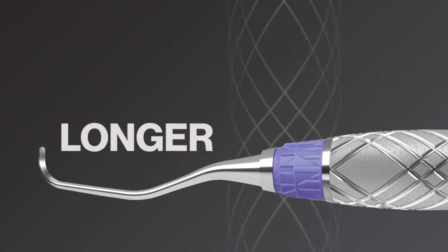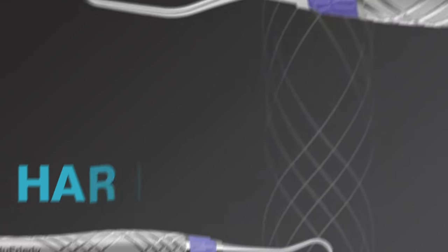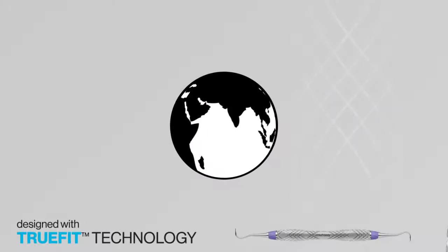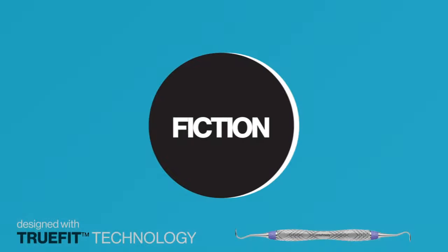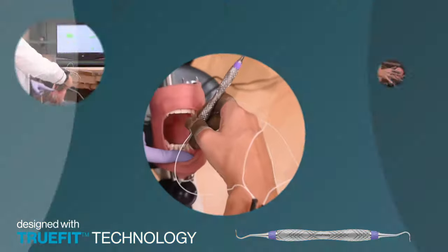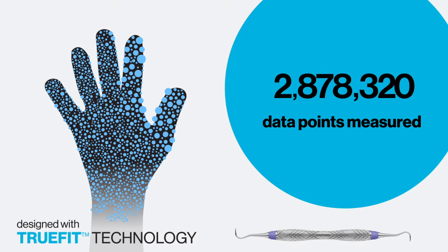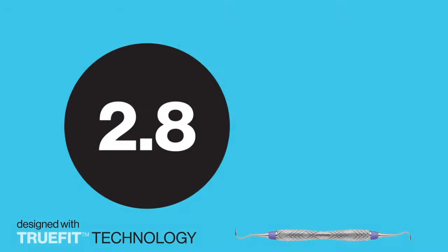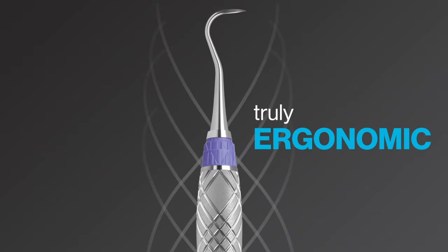All of these features work together in perfect Harmony to be truly ergonomically fit just for you. Harmony Ergonomic Scalers and Curettes are designed with TrueFit technology. Hu-Friedy Group scoured the globe testing different designs and gathering input with one goal in mind: to distinguish factual parameters that could be used to develop a truly ergonomic instrument handle. TrueFit technology is an advanced sensor-based technology system that measured over 2.8 million data points, creating a massive database to improve dental ergonomics. That is 2.8 million reasons to believe that Harmony scalers are scientifically proven to be truly ergonomic.